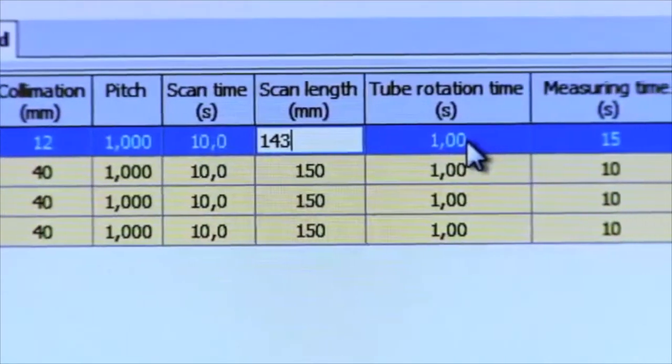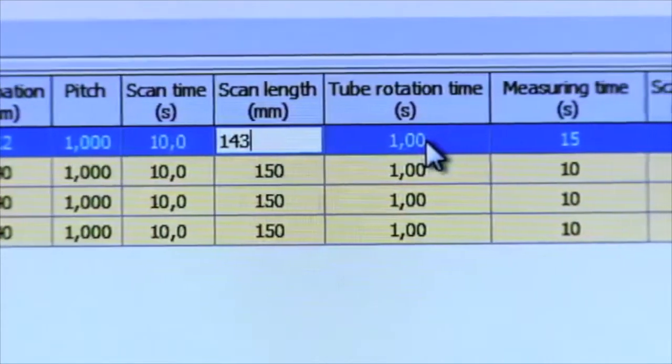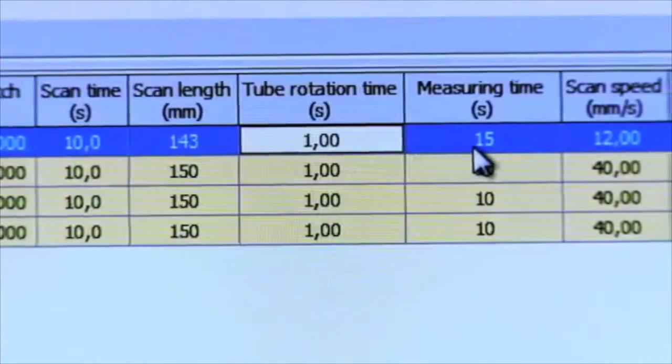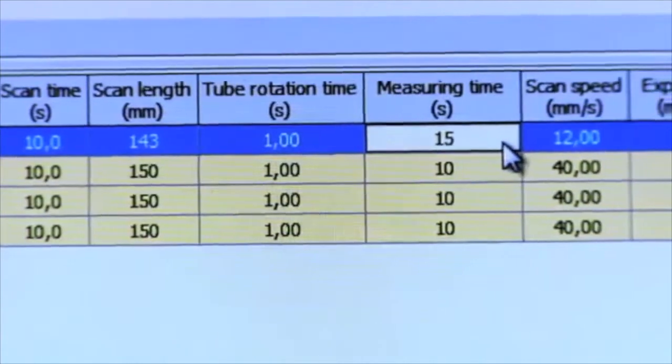For helical scans, two collimation lengths must be added to the length you see in the scouts. Tube rotation time.